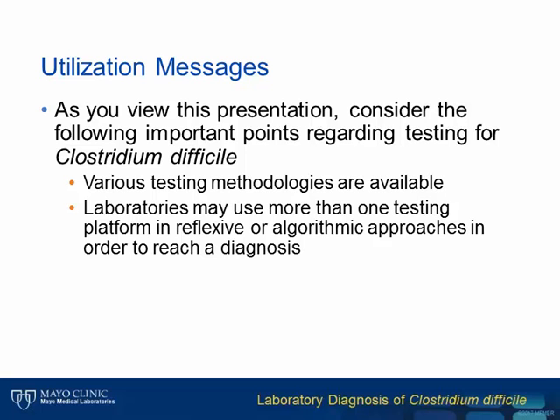Let's start with some test utilization messages. As you view this presentation, consider the following important points regarding laboratory testing for Clostridium difficile. Various testing methodologies are available, and laboratories may use more than one testing platform in reflexive or algorithmic approaches in order to reach a diagnosis.